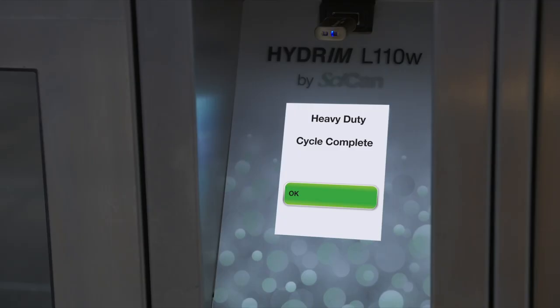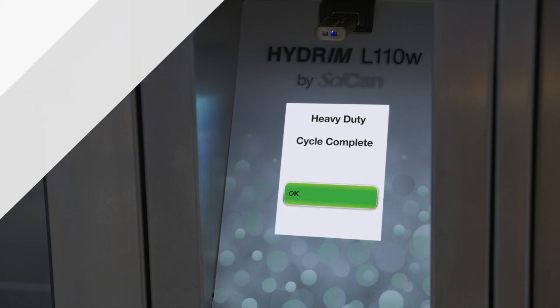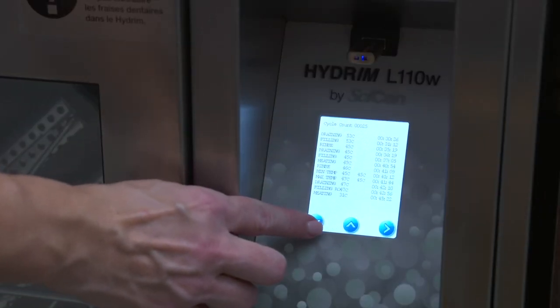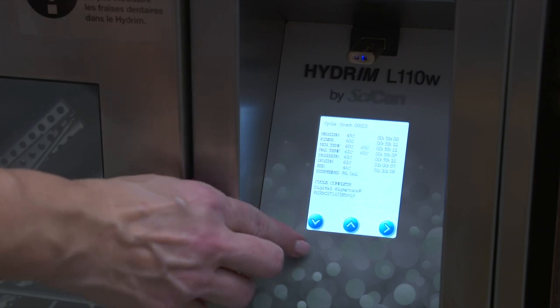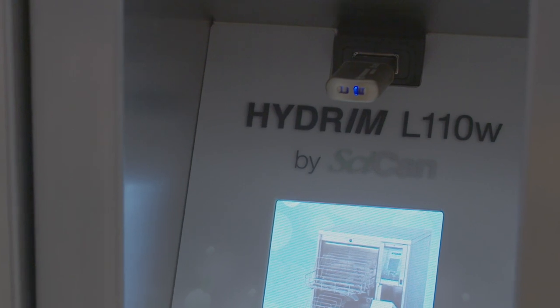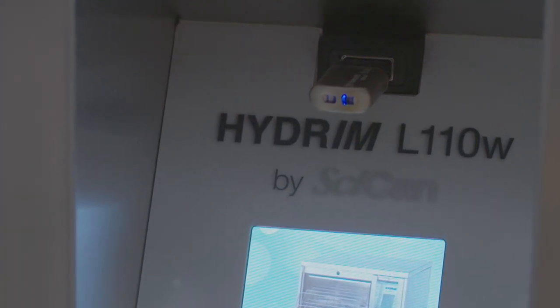Once the cycle is complete, press OK to release the door. Cycle data is automatically stored in the memory and can be accessed later. You can also copy the cycle data onto a USB stick and transfer it to a computer for logging purposes.